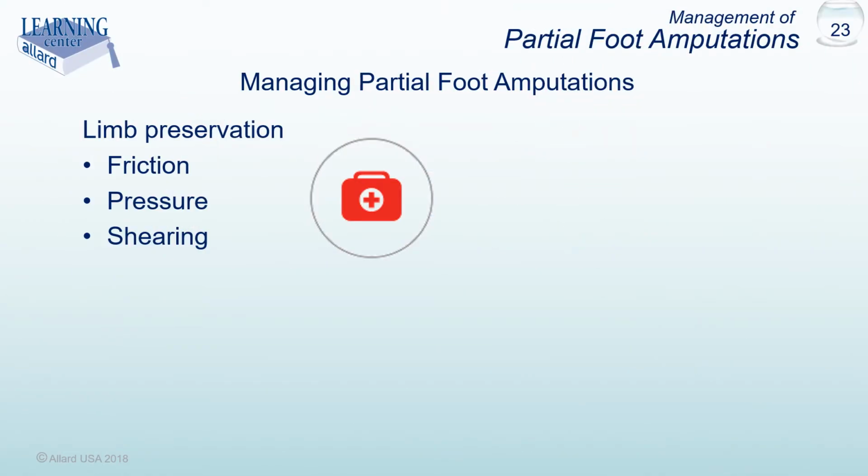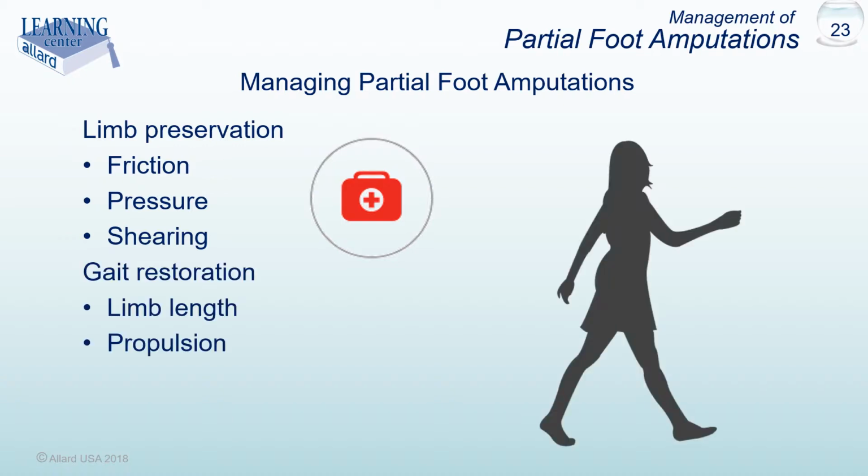Now that we've seen the challenges imposed by partial foot amputations, it's time to discuss interventions that will help preserve the limb by managing friction, pressure, and shearing, and interventions that will help restore gait function by restoring limb length and propulsion.